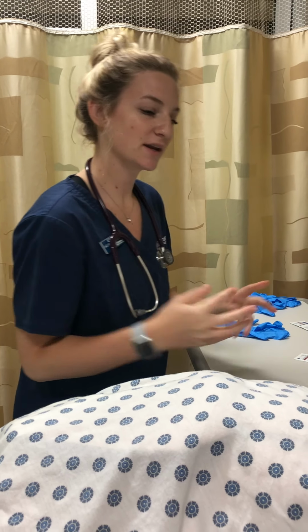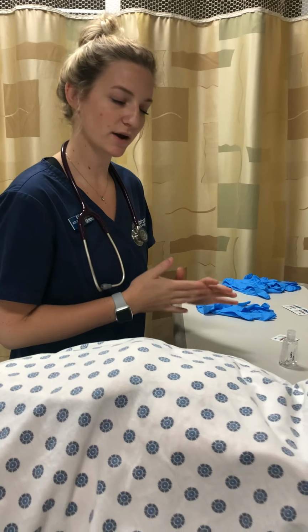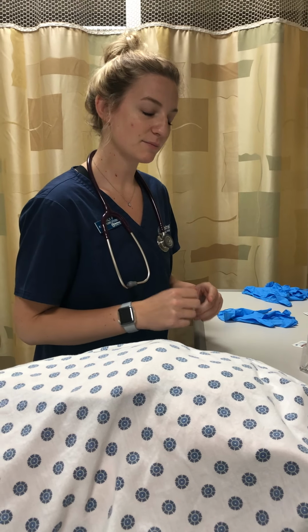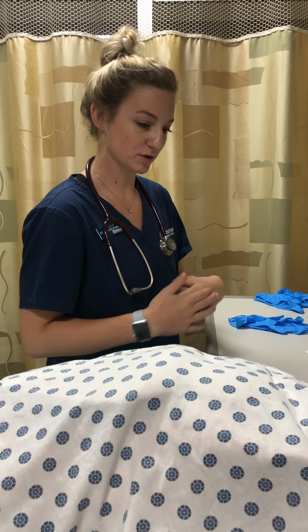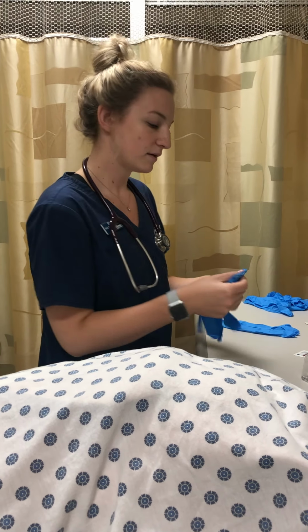So I'm just gonna get a set of vitals right away. So took his blood pressure 120/80. His respiratory rate is 16. His temperature is 98.7. His O2 stat is 98%. So everything's looking good. I'm gonna put my gloves on.